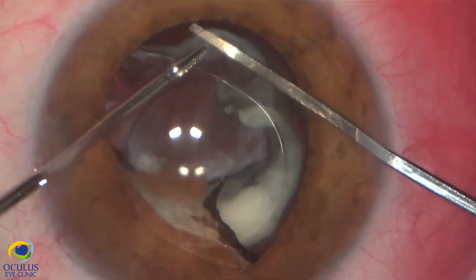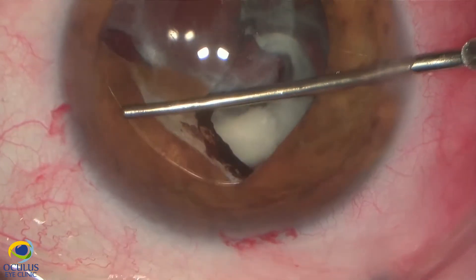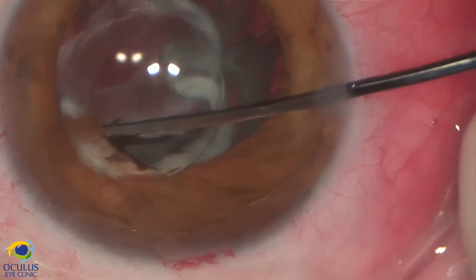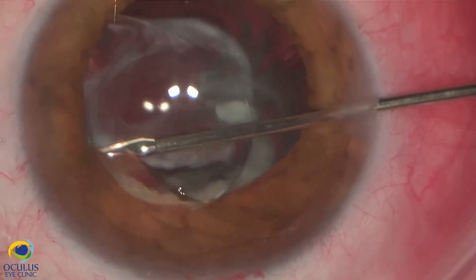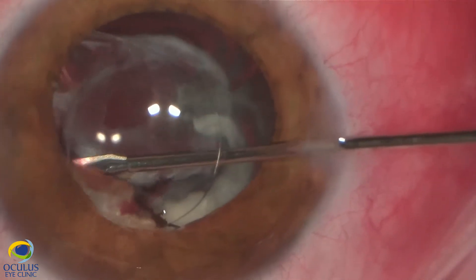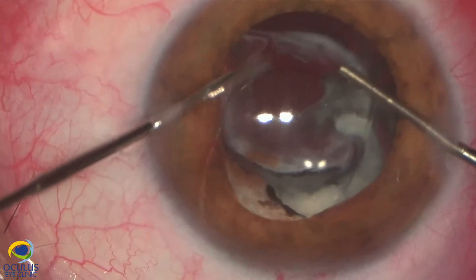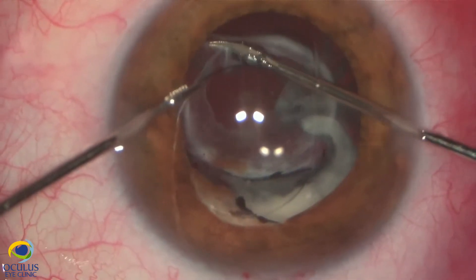We tried to open the bag gently under methylcellulose with very gentle and fine manoeuvres, and we rotated the IOL until we took out the superior haptic. We put it on the iris. We tried to detach it but it was not possible with a spatula, so we decided to cut it with fine scissors — the most important synechia being between the iris and the IOL optic. We then did the same manoeuvre for the inferior haptic with very gentle rotation movements, managing to take it out from this closed fibrotic bag and put it on the iris.